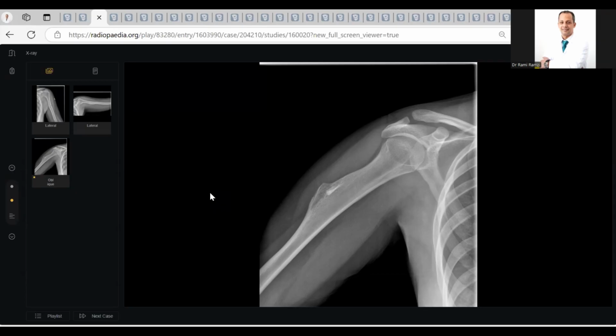What will you do next? Sir, first I would convey these findings to the orthopedician and ask for any previous imaging if it is a known case, and if there is a recent onset of pain or a recent onset of swelling. The patient has pain in his arm. What will you do next? To do an MRI and see for any transformation or any secondary mass effect changes, sir.